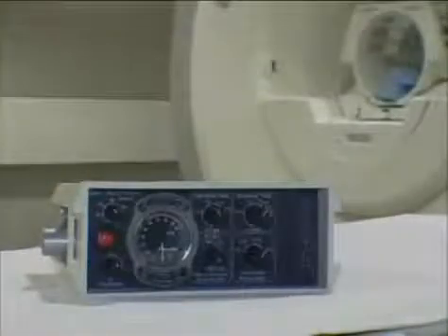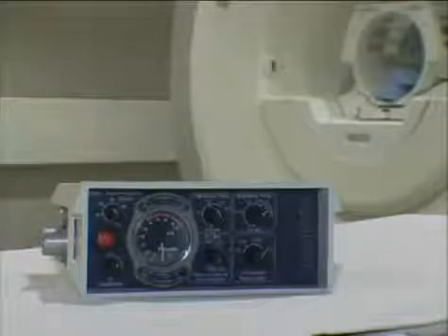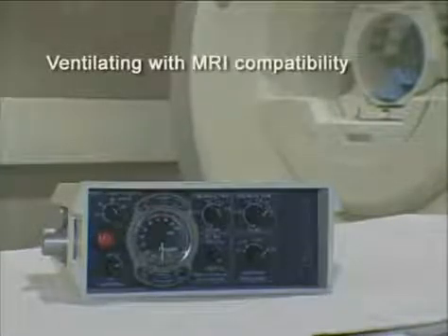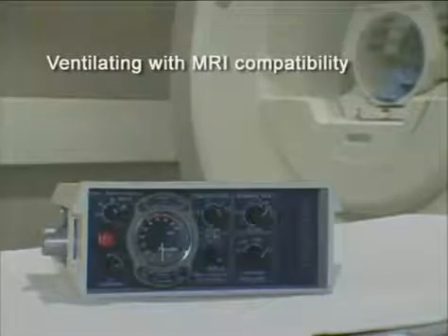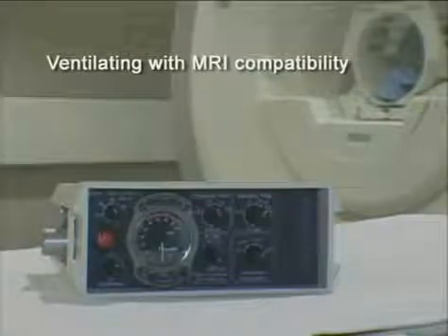Smiths Medical has type-tested the ventilator and assessed it as MRI compatible in a magnetic field of 3 Tesla with a field gradient of 430 Gauss per centimeter. Following FDA guidelines, Smiths Medical tested the ventilator at the most extreme field strengths and gradients, and both measures were within the bore of the magnet.